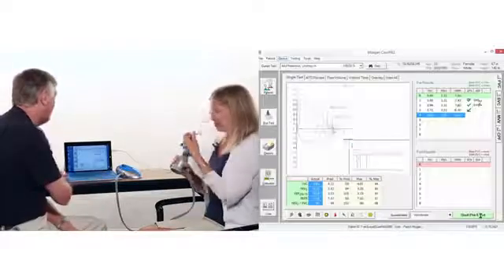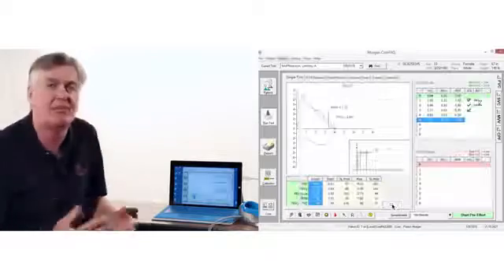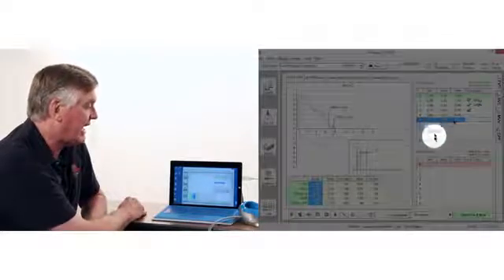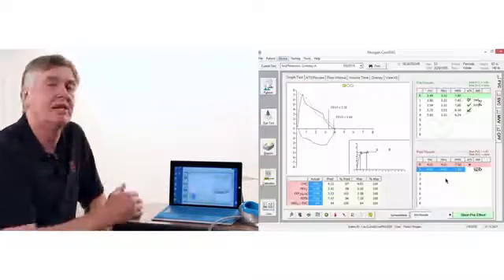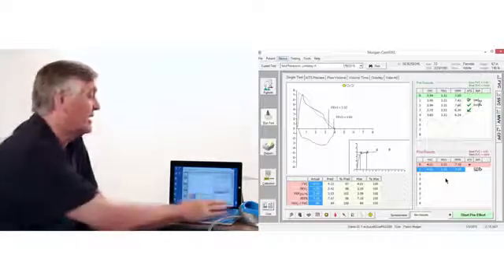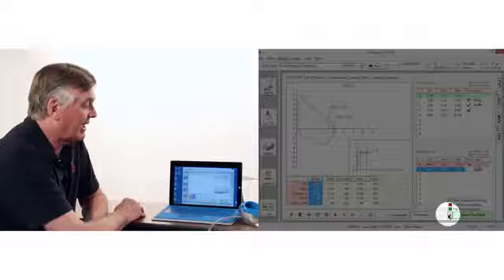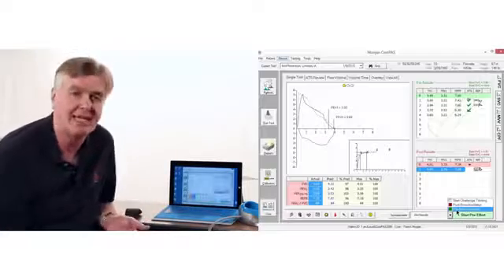And only now do I realize, oh my goodness, we saved that as a pre-bronchodilator test and we want it to be post. So I can literally drag that effort down and place it into post. So we can correct that mistake. And then to continue testing in post, simply a P key will allow us to choose pre or post, or I can click on the little up arrow and I can choose pre-post or begin challenge.